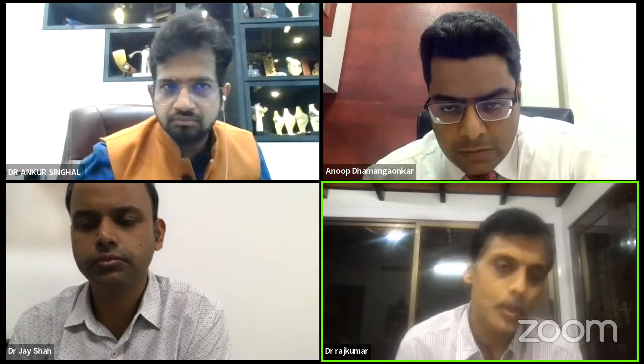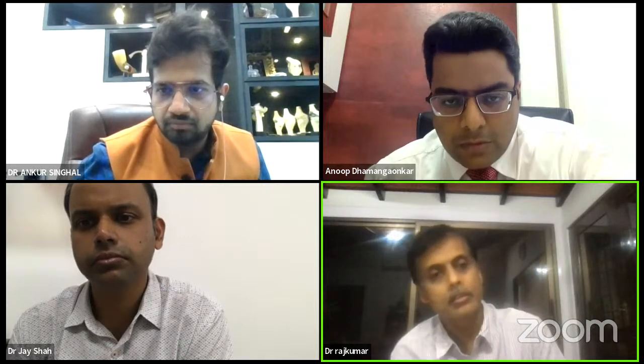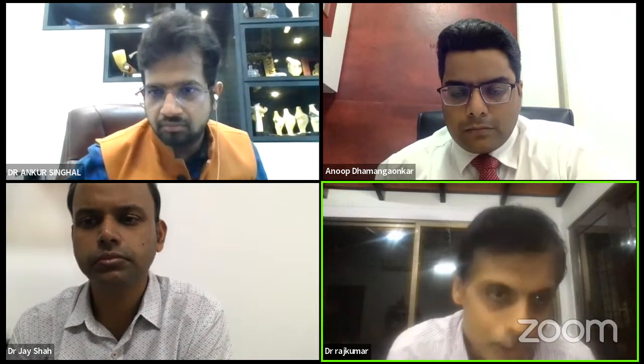The Revitan stem starts from size 13. And one company, the Mathys company, their MRP Titan starts from 12. So that is where your preoperative templating helps, if you are planning properly.